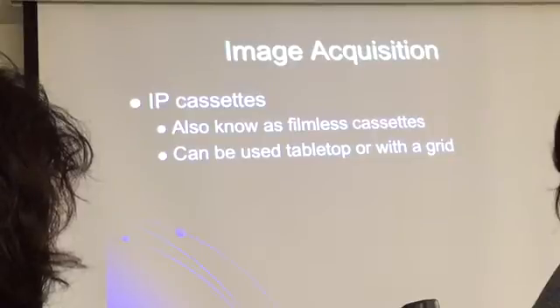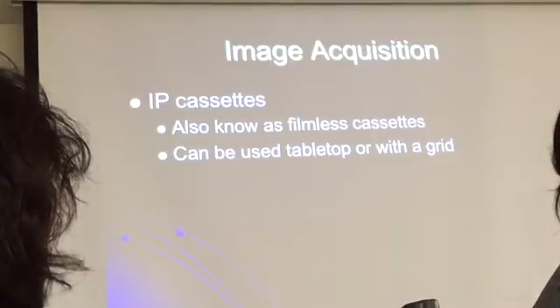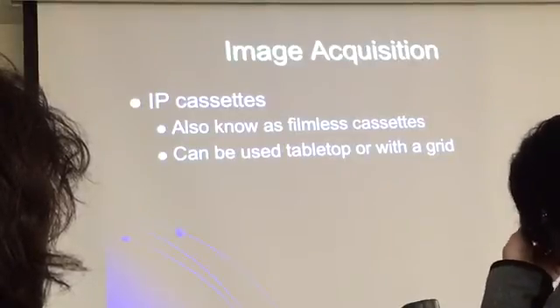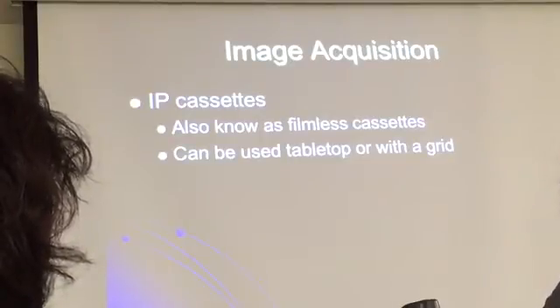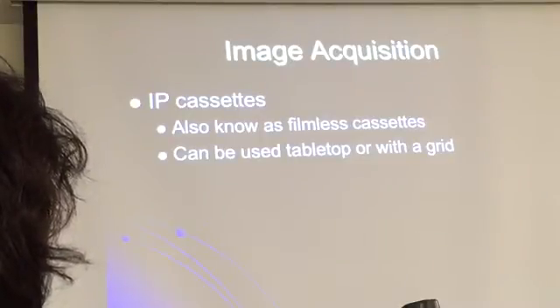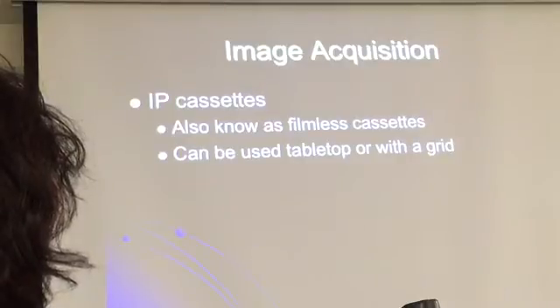Hospitals can pay that, but if you have a small clinic, you might not be able to. So typically doctors, and even hospitals before they went fully DR, started with CR just to get them going in the digital era.